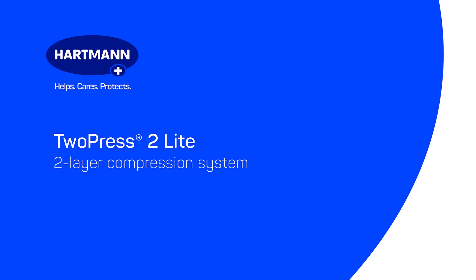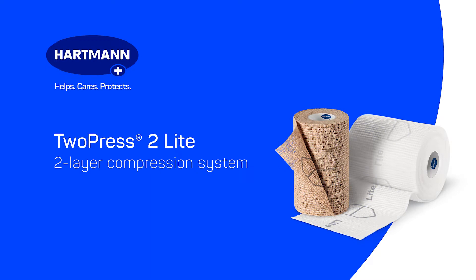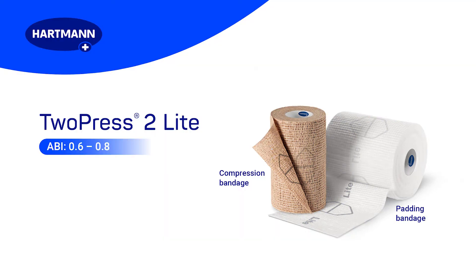2Press 2 Lite is a two-layer compression system like regular 2Press 2, but it creates less pressure for patients with arterial deficiencies or those who cannot tolerate full compression. The kit consists of a padding bandage and a compression bandage, and it is not made with natural rubber latex. When applied together, the two components bond and form a compression system that may be left in place for up to seven days, depending on the condition of the wound and on the wear time of the wound dressing. 2Press 2 Lite can be used for long-term compression therapy, which requires a reduced level of compression.